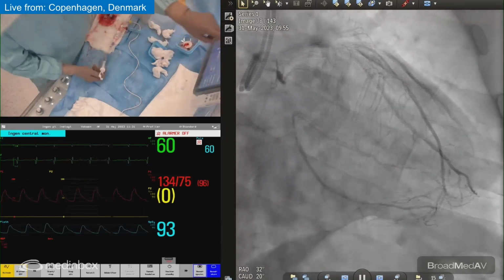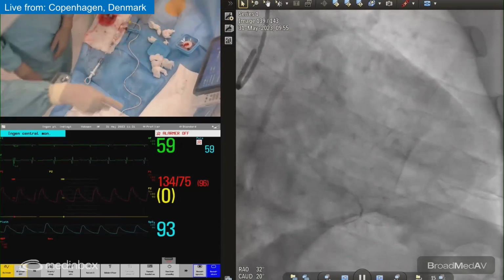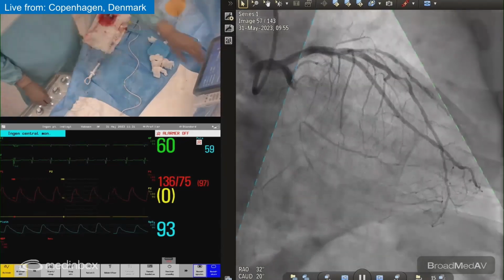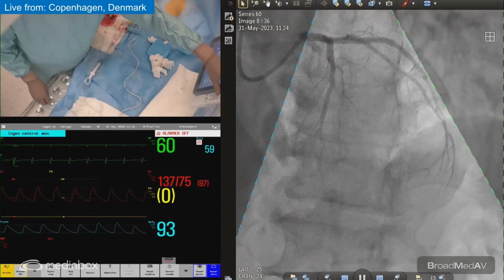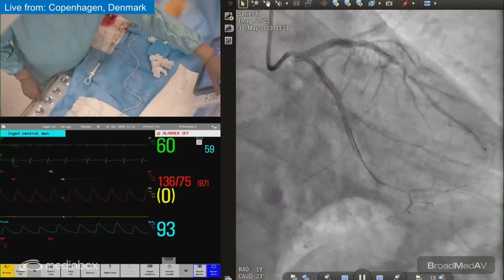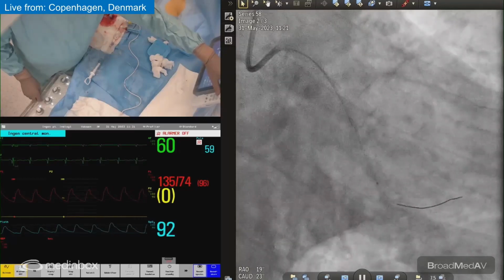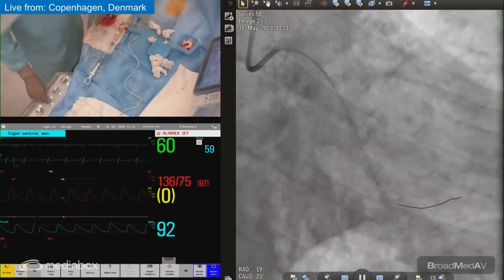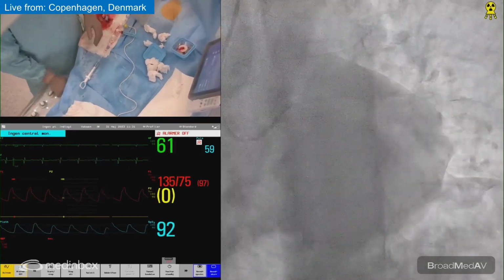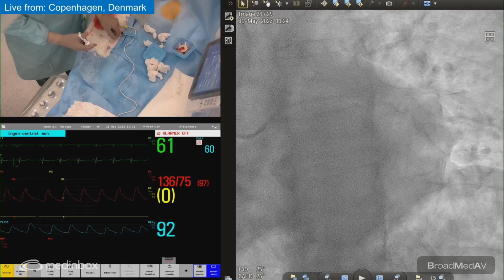Yeah, we still have that, but that's the first. That is the setup. Okay. Oh yeah, that was the circ. Actually, for the right, we're just discussing whether we have any collaterals for the right, which is totally occluded as well, but it doesn't seem like that. So now we have the final shot from here.